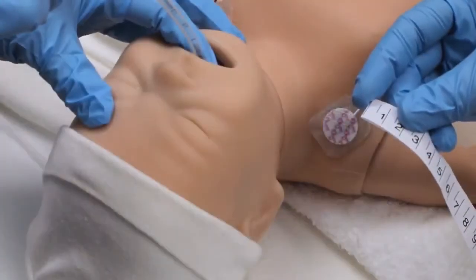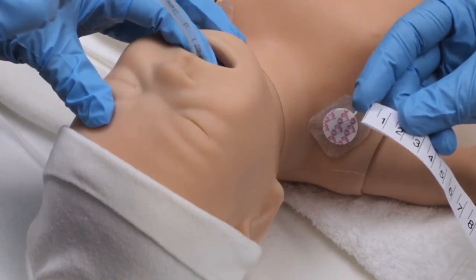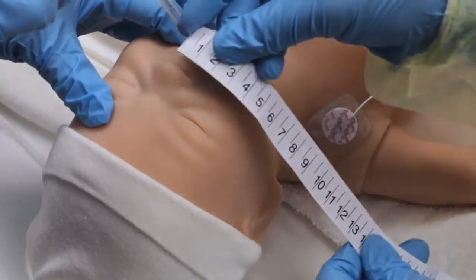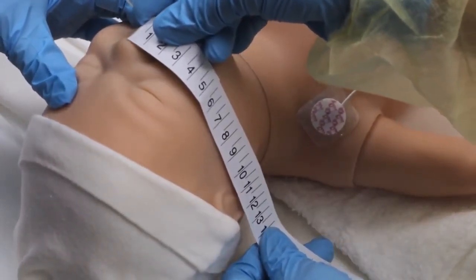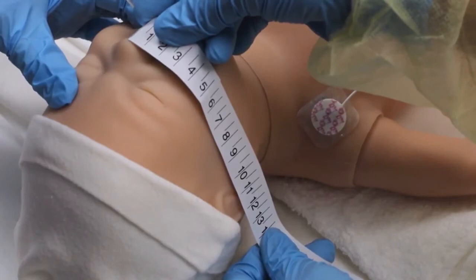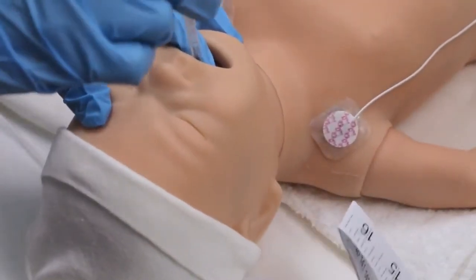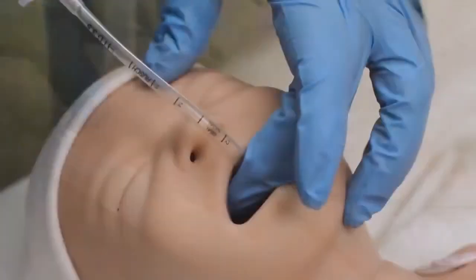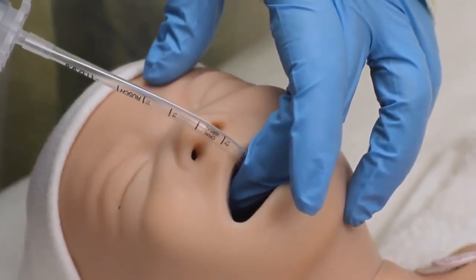The nasal tragus length is one method for determining correct insertion depth. This can be done before or after intubation. Measure the distance from the baby's nasal septum to the ear tragus and add 1 centimeter. This baby's nasal tragus length is 10 centimeters. Add 1 centimeter for an insertion depth of about 11 centimeters. The 11 centimeter mark on the tube should be at this baby's lip.